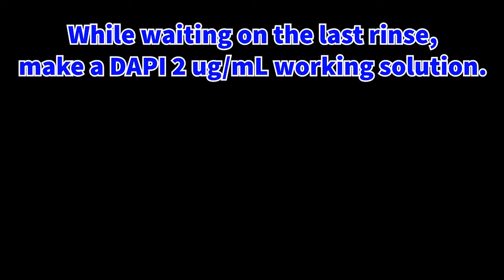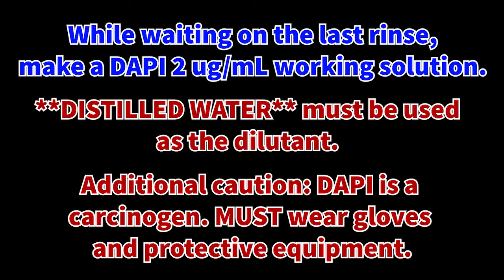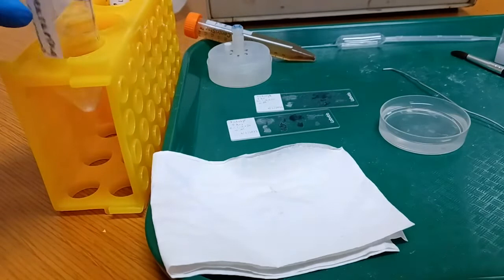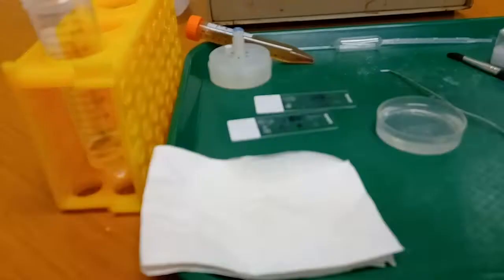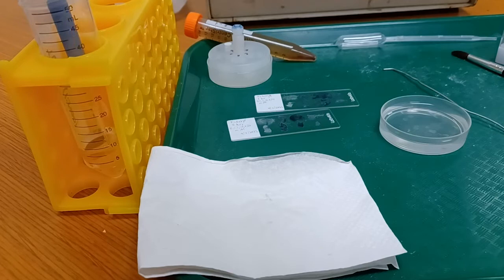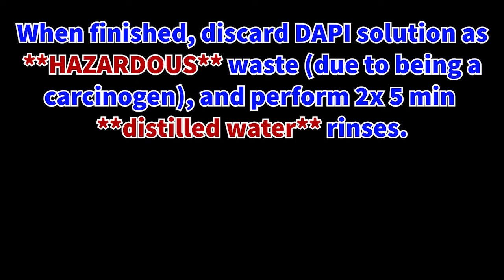While waiting on the last rinse, make a DAPI 2 mcg per mL working solution. Distilled water must be used as a diluent, because otherwise DAPI will precipitate in PBS. An additional caution: DAPI is a carcinogen. You must wear gloves and protective equipment if you have not already been doing so. Add 10 mL distilled water and then add 200 microliters from a 0.1 mg per mL stock. Discard the distilled water in the netwell basin, pour in this fresh DAPI solution, and set it on the shaker for 10 minutes. When finished, discard this DAPI solution as hazardous waste, and perform two 5-minute distilled water rinses — each of these rinses should also be discarded as hazardous waste due to DAPI contamination.